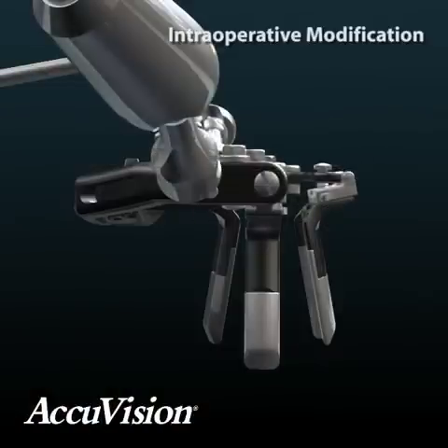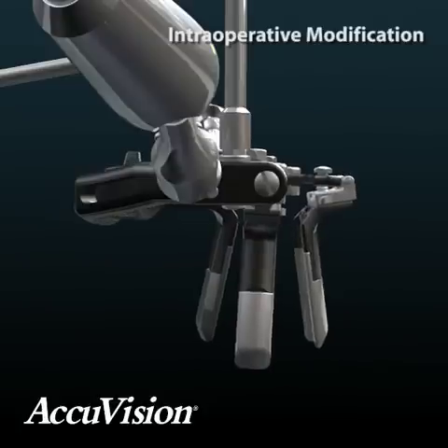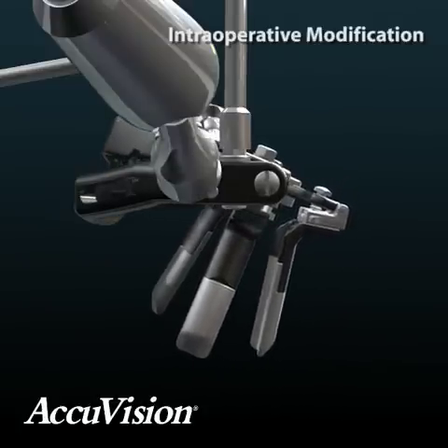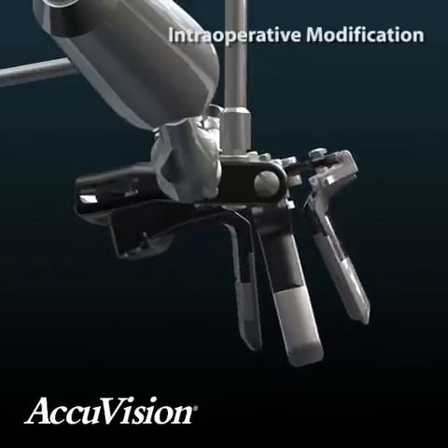The pivot point construction of the retractor frame allows for additional variability. Airplane angulation of the inner frame provides even greater visualization without having to destabilize the operative setup or blade positionings. This airplane angulation provides up to 45 degrees of variability, helping to provide additional exposure to the surgical site.